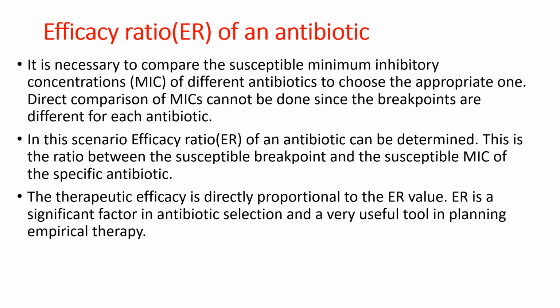It is a ratio of the susceptible breakpoint to the susceptible MIC of that particular antibiotic. It is necessary to compare the MICs of different antibiotics against different organisms. So efficacy ratio helps us to understand whether the particular MIC is susceptible or not.